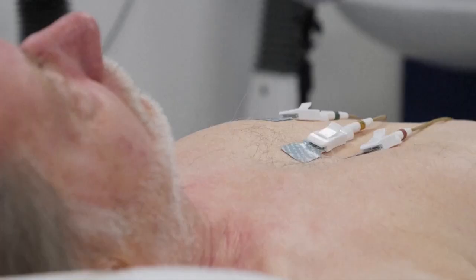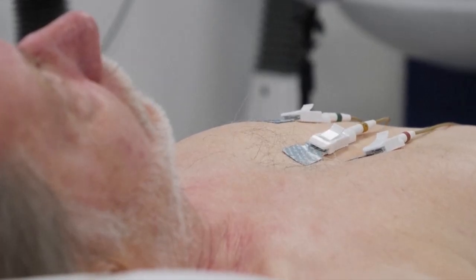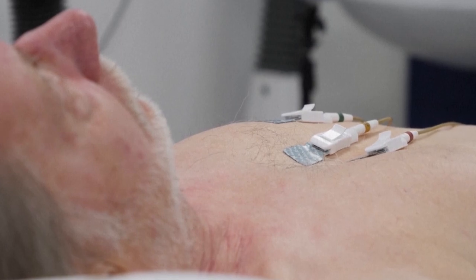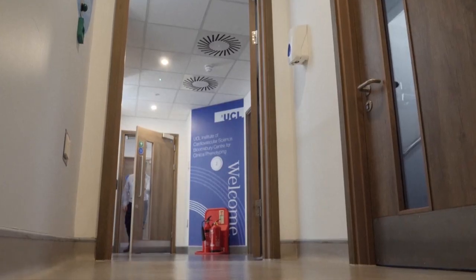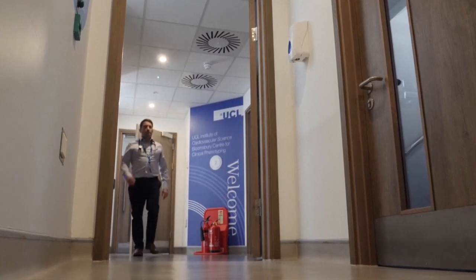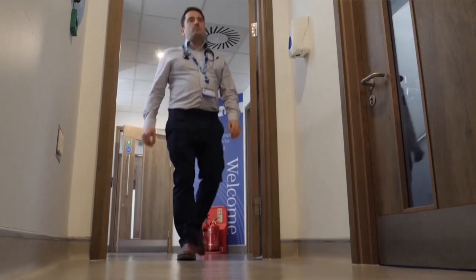Here's another doctor who helped develop the ECGI vest. Setting up a normal 12-lead ECG involves 4 leads on the limbs and 6 leads along the chest. One of the issues with it is that we have the gel electrodes, so they can be quite uncomfortable for patients, and they can also be skin irritants. And also these gel electrodes, they can only be used once, so they get thrown away afterwards.